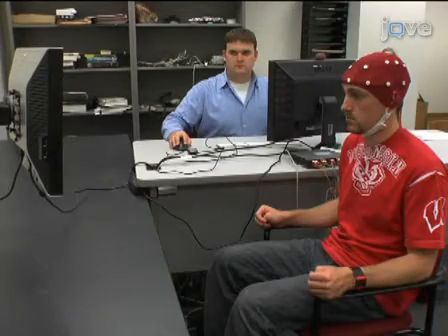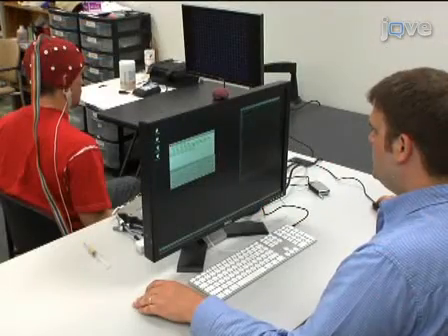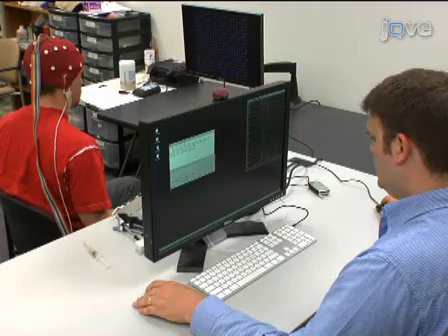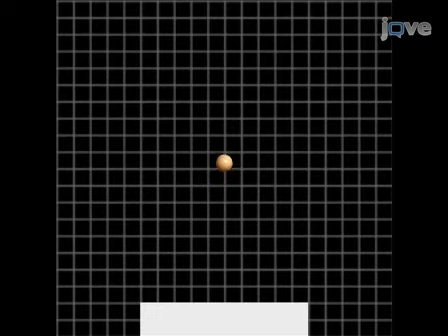Now that you have configured the system with the correct settings, it is time to start the experimental task. Conduct the trials in a dimly lit room with a comfortable chair for the subject. During trials, the subject should keep movement to a minimum to reduce artefacts. There will be breaks between trials. For the first trials, constrain the cursor to the axis of the target — that is, if the target is at the top or bottom, it is only possible to move the cursor up or down, and if it is at the left or right of the screen, the subject can only move the cursor left or right. One of the targets appears for one second, the cursor appears in the middle of the screen, and the subject then has five seconds to use the appropriate imagined movements to direct the cursor to the target.